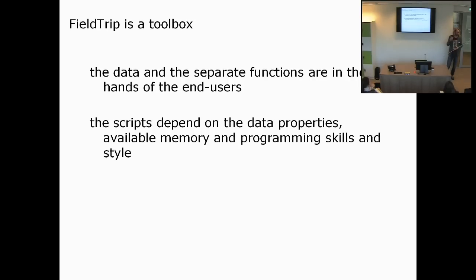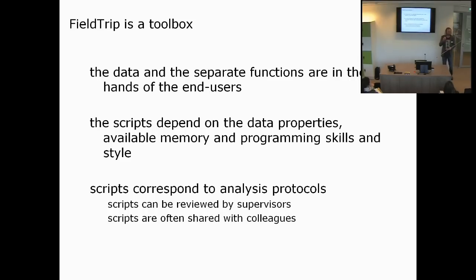It also depends on your programming skills, on your programming style. So scripts can be quite different between researchers. But the important thing is that the script corresponds to the analysis protocol. That means that you can show your script to your colleagues, and you can share your scripts with them.